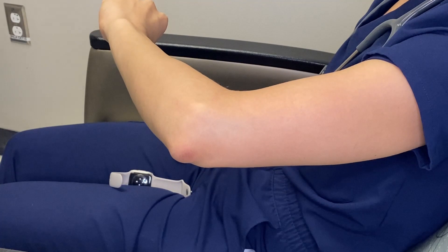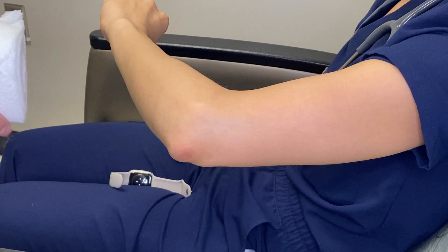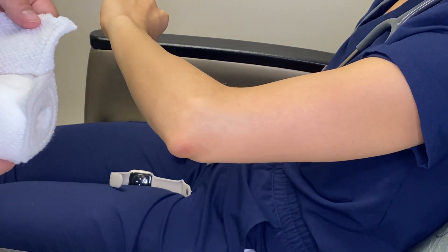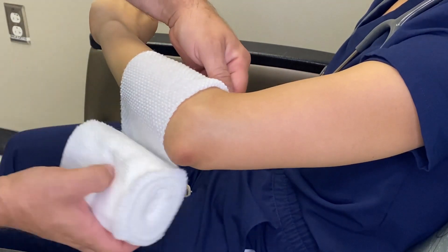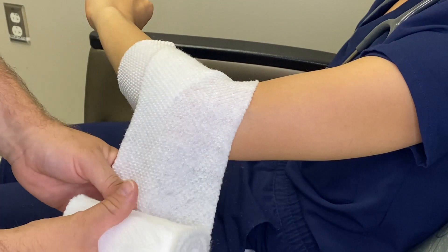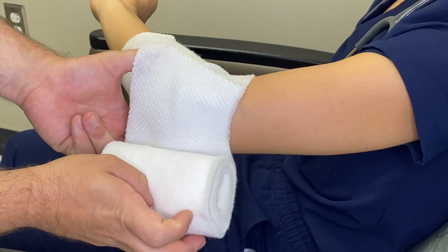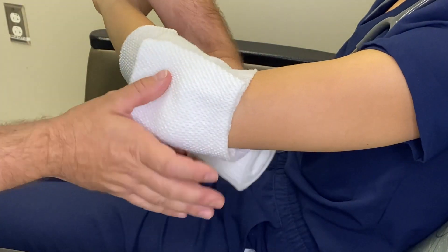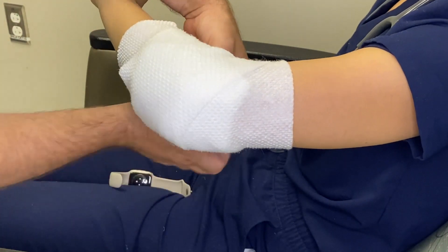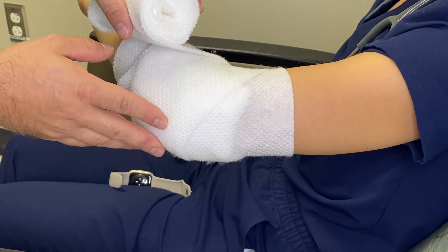When rolling over bony prominences such as elbows, styloids, knees, and heels, you need to do a fan fold method and then capture it with a figure eight. You start by ending the 50-50 method, go over the bony prominence, and then fold it back so you have three layers right there. Then do a figure eight, giving you four layers protecting the bony prominence.